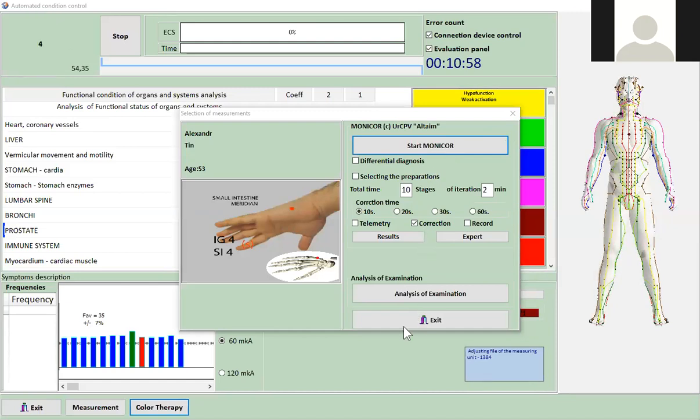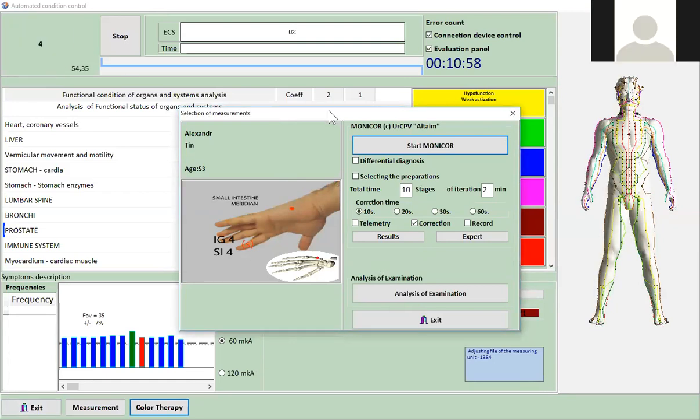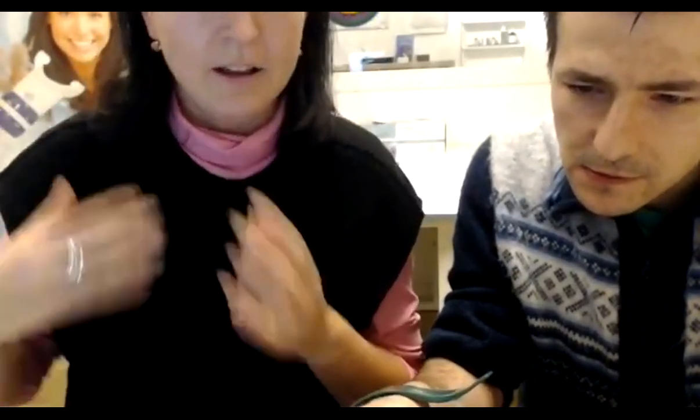Well, Victoria, I have a question. If we're only doing, say, 10 minutes or 15 minutes of a treatment, will they get the same results as if we just let it go for 40 minutes or 60 minutes? I mean, will they also be balanced in that 15 minutes, or will they just come up a little bit? It also depends if the patient does not have much energy from the beginning, as I was explaining. If the ring that you get in the first picture, with meridians, is very, very small, it's better to start with low numbers because the person can be activated too much.